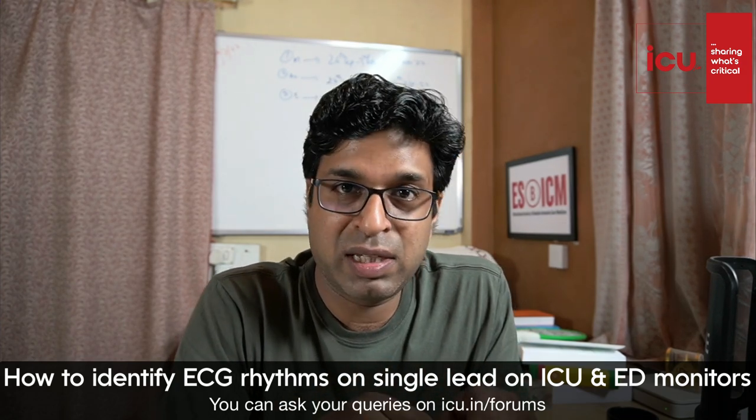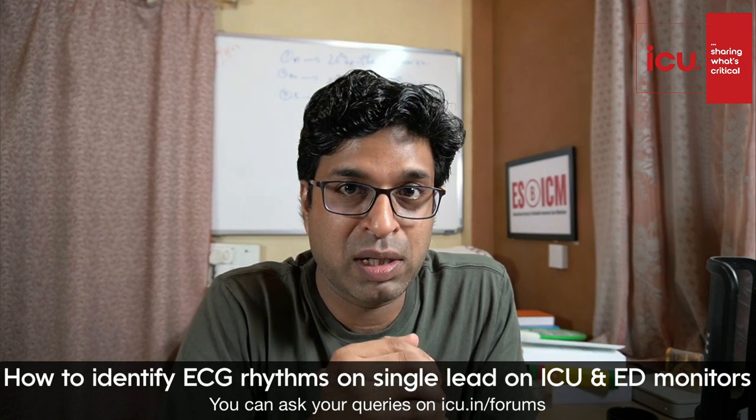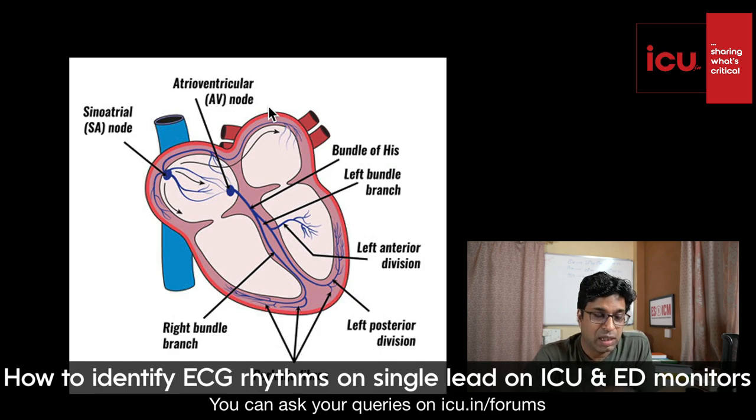So we will first see how the rhythm generates, and then we'll see the different rhythms coming on the ECG monitor. So let's start. This is the conduction system of the heart. You can see that this is your SA node, sinoatrial node. From here the fibers go to the AV node, and also to the other atria. From AV node, bundle of His to the ventricles. So you need to identify only four places from where a rhythm can originate when you are identifying a rhythm on an ECG monitor or ICU monitor.